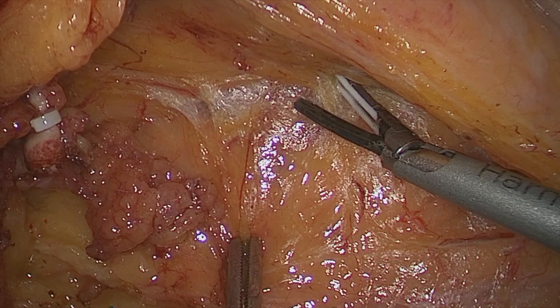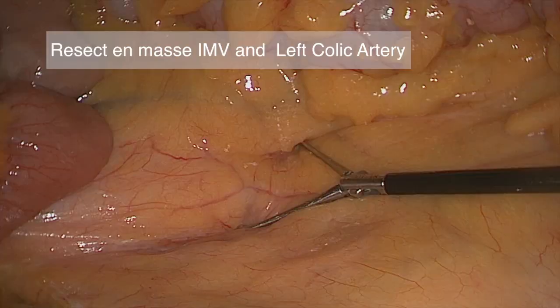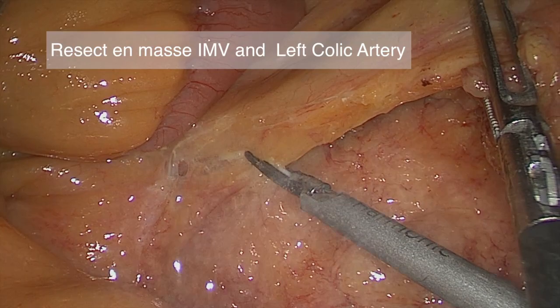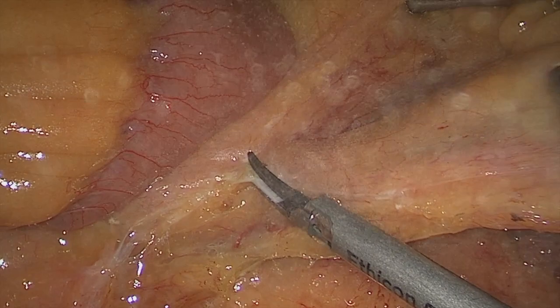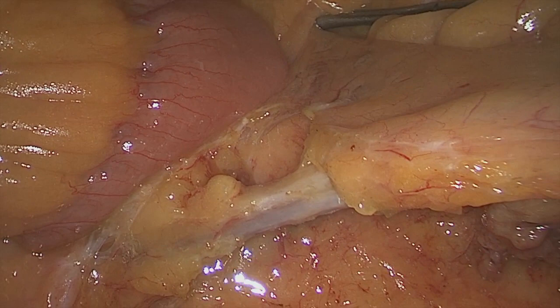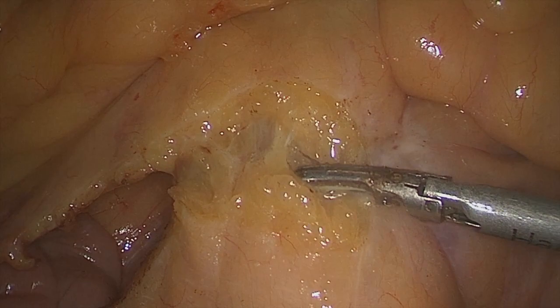The gonadal vessels and the ureter are located beneath Toldt's fascia, which is visually recognizable. The inferior mesenteric vein is resected after we have sufficiently swept through the inferior mesenteric artery and the corresponding lymph nodes. Further identify the left colic artery and the sigmoid colic arteries to be resected as well.